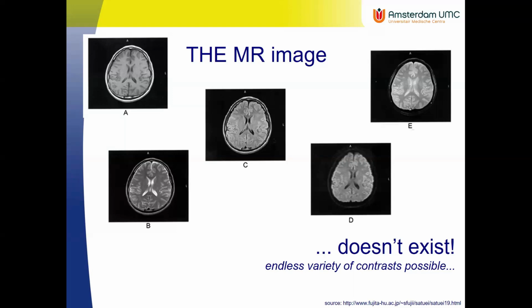And you can also imagine there are more settings you can do on the scanner, getting different kinds of contrasts and clinical applications. And even nowadays, new applications are emerging in research. So there's continuous development there. It's complex, but I think it's really interesting and very powerful. Okay, thank you.